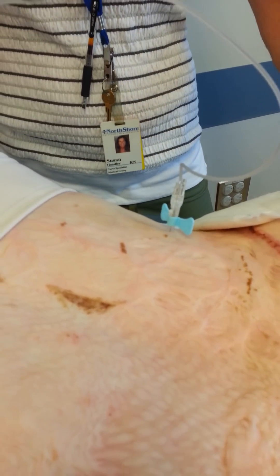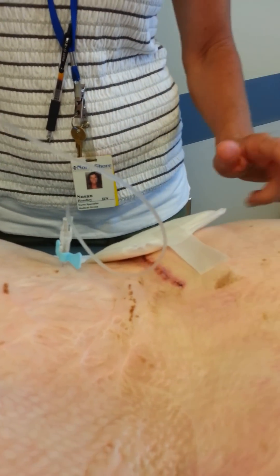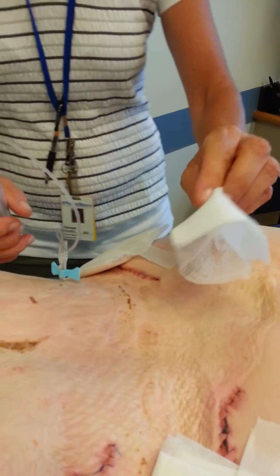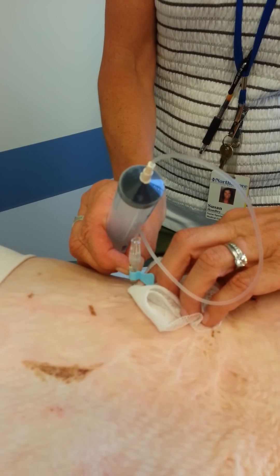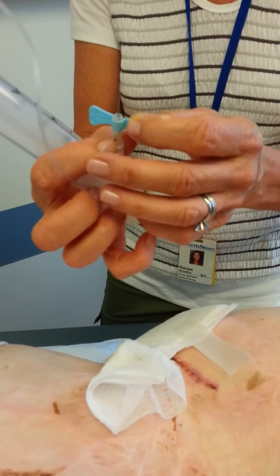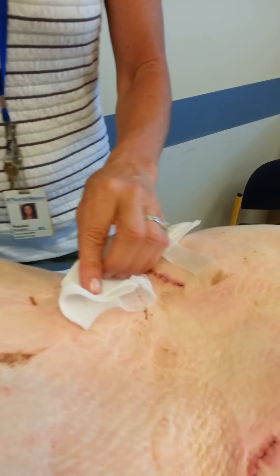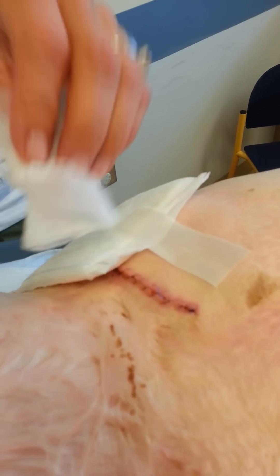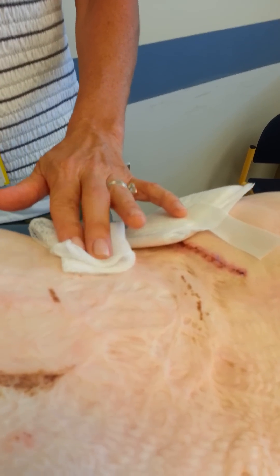I could feel all of this coming in this area, so we're stopping there. It's not a great example of brisk capillary refill because these are big expanders and they're really structured — it's going to take a couple fills. I always take a piece of gauze and just gently put pressure right where my needle is and just nice and evenly, not quickly, come out. And then eject this. Nobody will get stuck — it's just a safety mechanism. It would not be surprising for it to bleed at this site because we've gone through skin, but it's not. You can't even see where it was unless you look. Good job — that's it for that side.